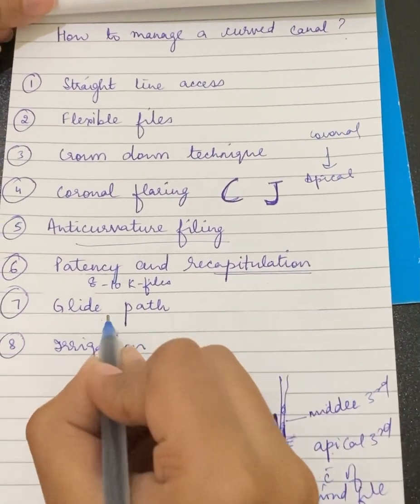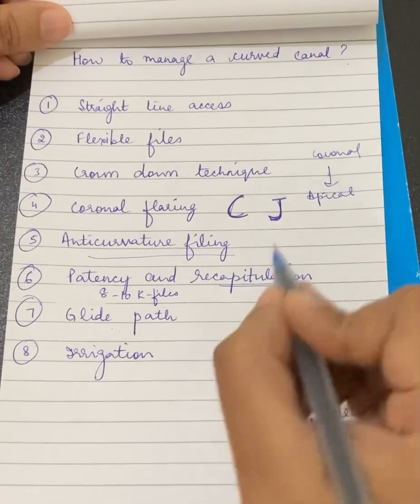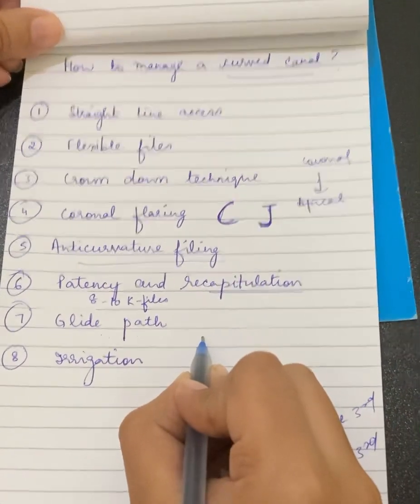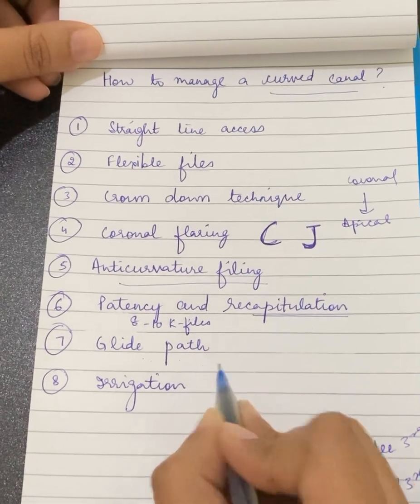Glide path: always prepare a glide path with small files before using rotary files. Rotary files will aid in managing your curved canals properly and in retaining the shape. But first you have to make a glide path with number 8 or 10 K files and then go on to the bigger rotary files.